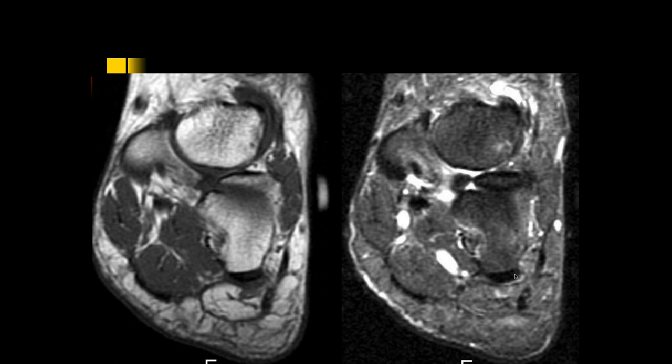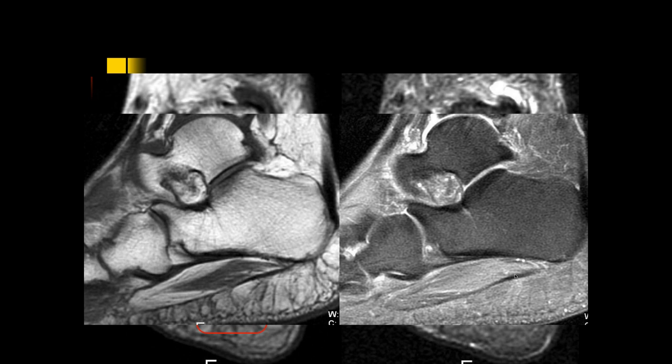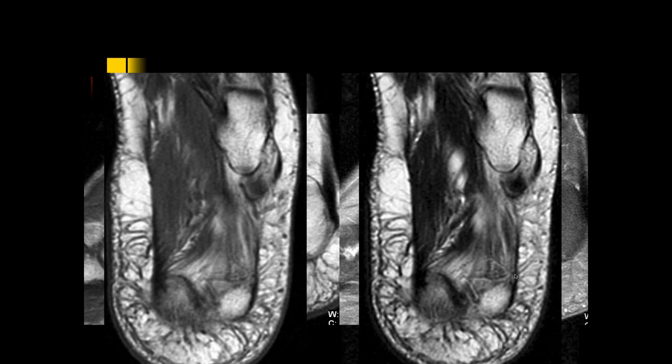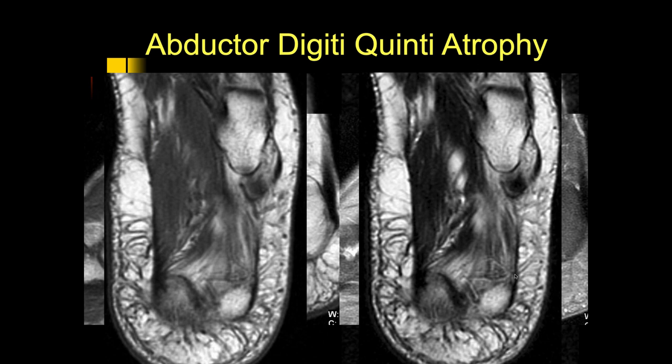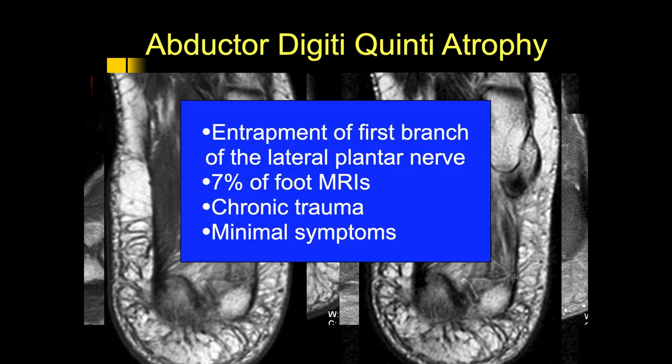There's quite a bit of atrophy of the abductor digiti minimi here, and here's what it looks like on the sagittal images — you can see the fatty atrophy, fatty replacement. It's pretty focal; the other intrinsic muscles look normal. This is focal atrophy of the abductor digiti quinti muscle, thought to be due to entrapment of the first branch of the lateral plantar nerve — Baxter's nerve.